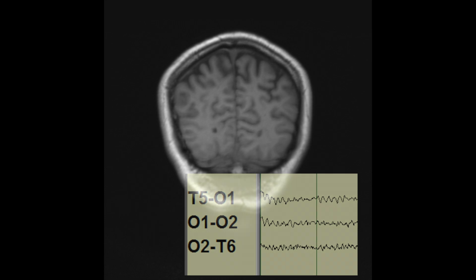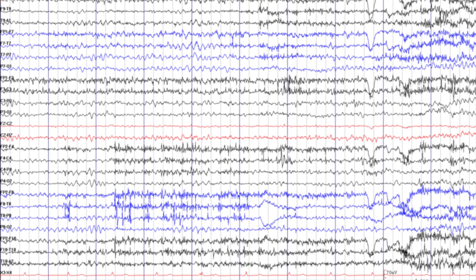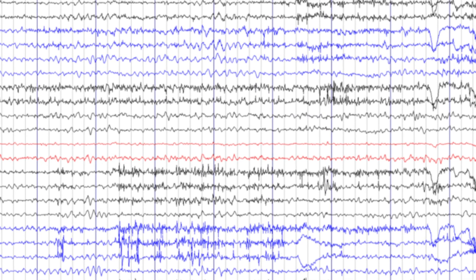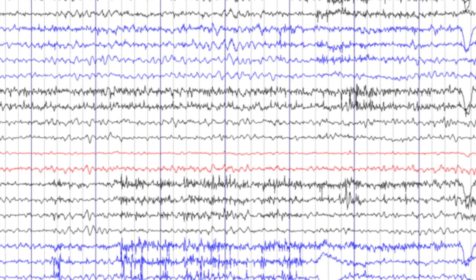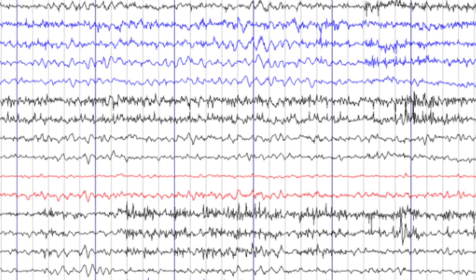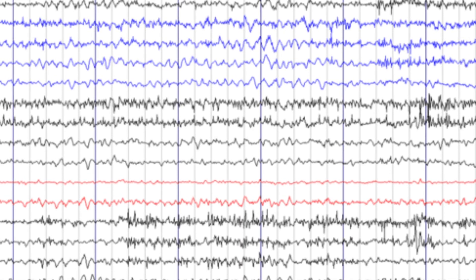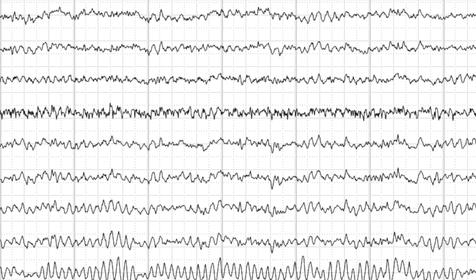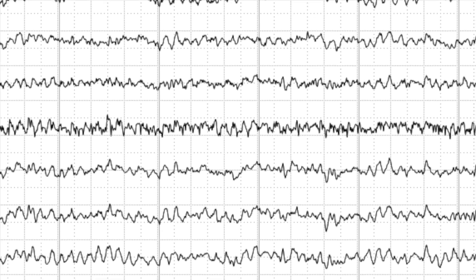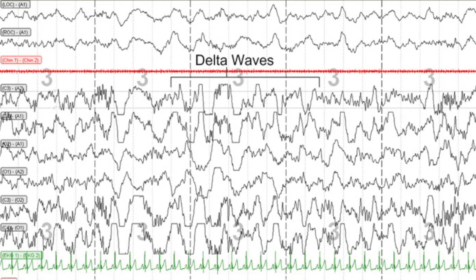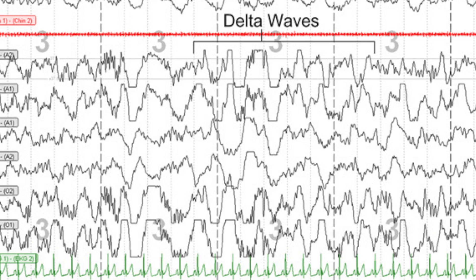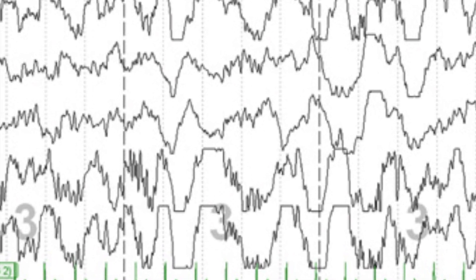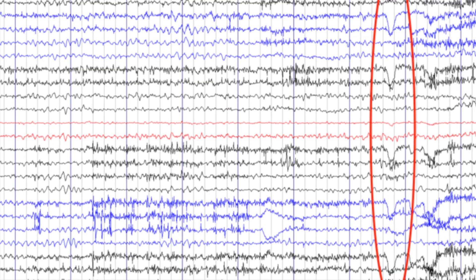The next thing to examine in the EEG is the background waves — what types of background waves are present, whether there are alpha-predominant waves, theta-predominant waves, or delta-predominant waves. In sleep, the alpha-predominant waves gradually change to delta-predominant waves with increasing levels of sleep.